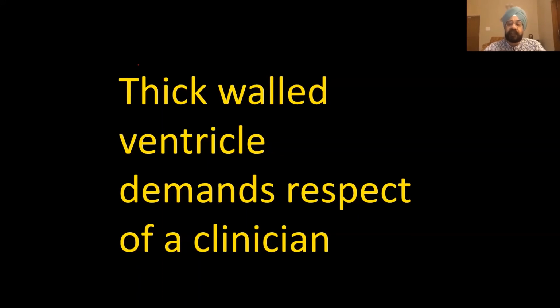Now, when do we say, sir, the LVOT gradient is significant in hypertrophic cardiomyopathy? Dr. Hari wants to know. So 30 millimeter or more resting gradient is considered significant. Provocable also, 30 and more is considered significant. Typically in hypertrophic cardiomyopathy, one-third will have resting gradients. In another 40% of cases, gradient can be provoked by multiple methods, and induced or resting gradient both are prognostically not good. 30 millimeter is the cutoff.